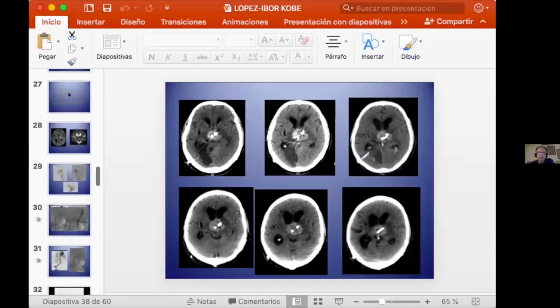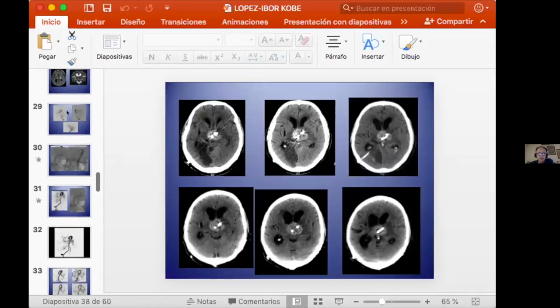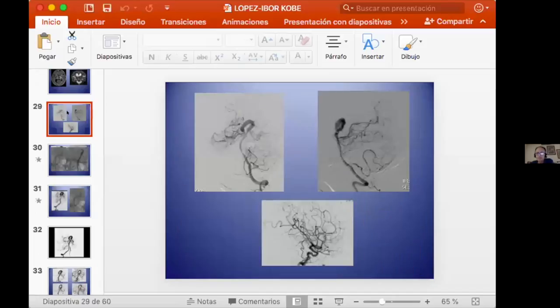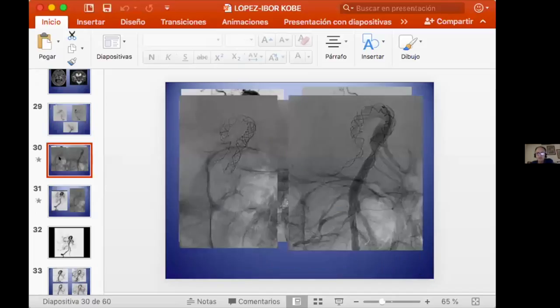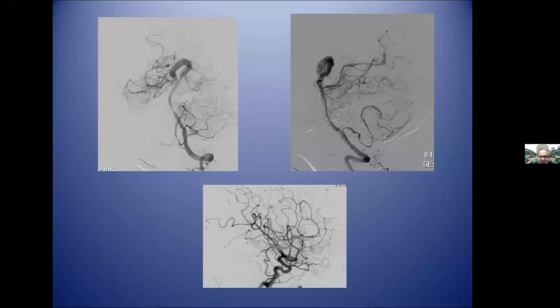Why? Because, just a minute, I think it's this. But you see here, take it back. Look, you are here. Take AP. Okay, this is AP. What is this one?